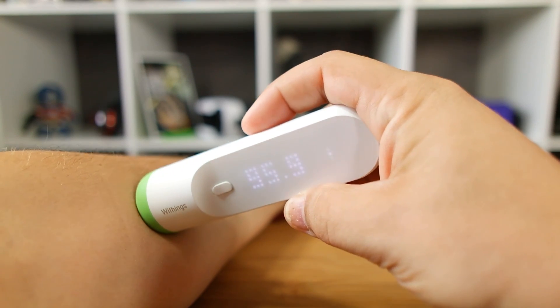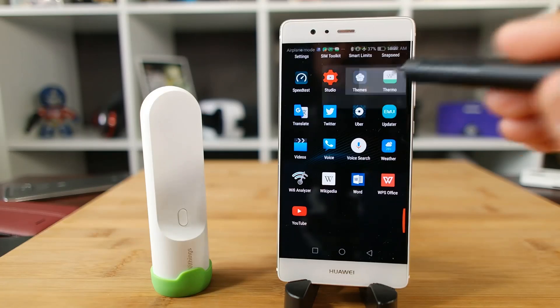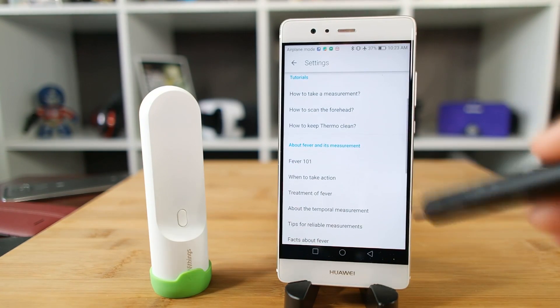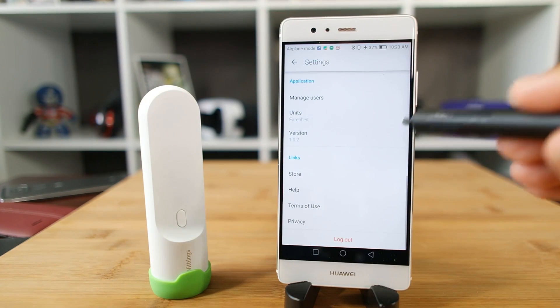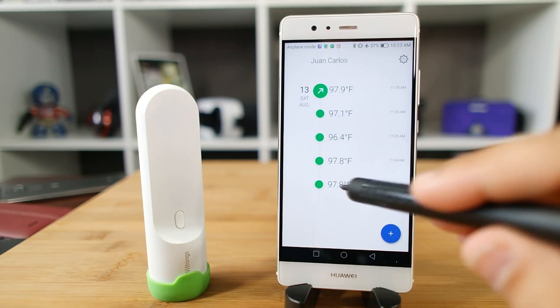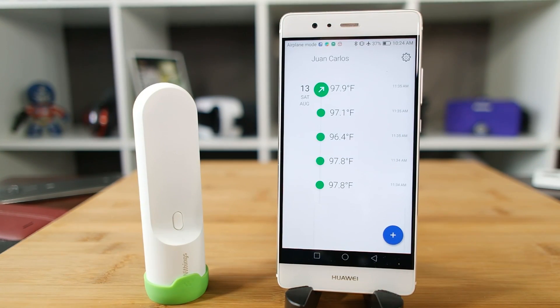After taking a temperature, the results are displayed on the unit, but are also sent to your phone where they can be separated by the different people in your household. You can note results and add additional comments or catalog different symptoms. If you need to share results with a doctor or a nurse, it's all saved right here. This app also serves as a handy resource for answering questions about providing care for fever and other ailments.